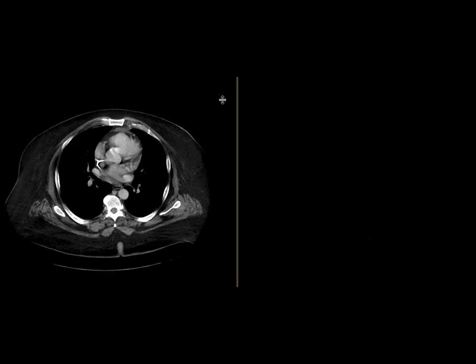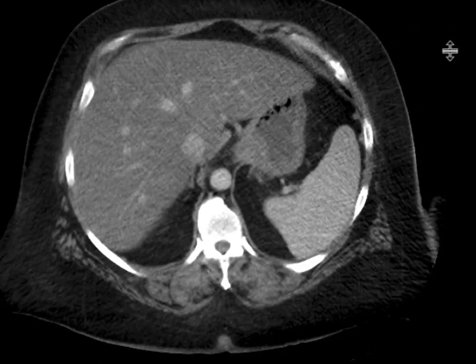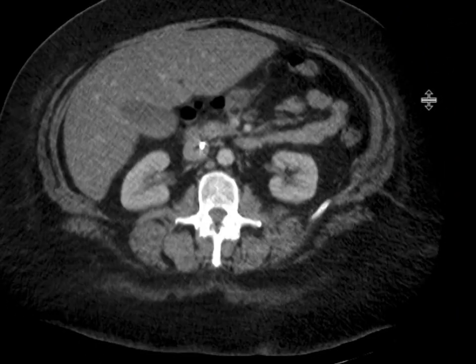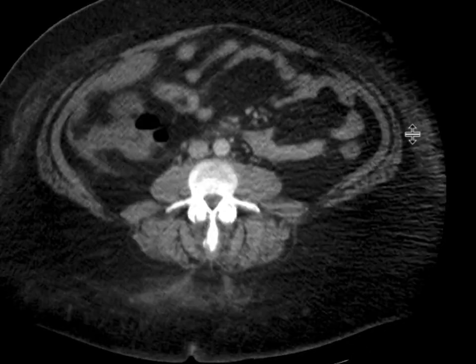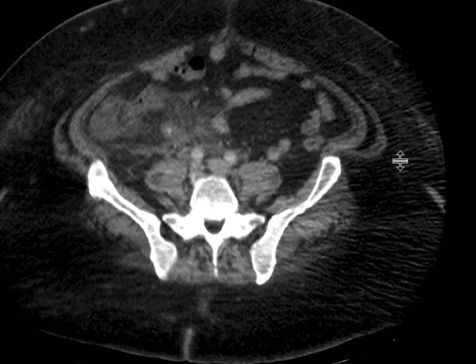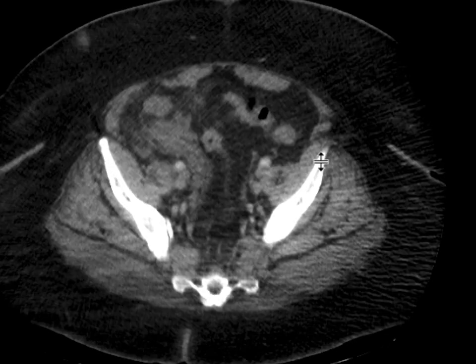This patient comes in with right lower quadrant pain and a CT scan was obtained with intravenous contrast. As you scroll downwards, we're going to focus in the right lower quadrant where we see a lot of inflammatory change.